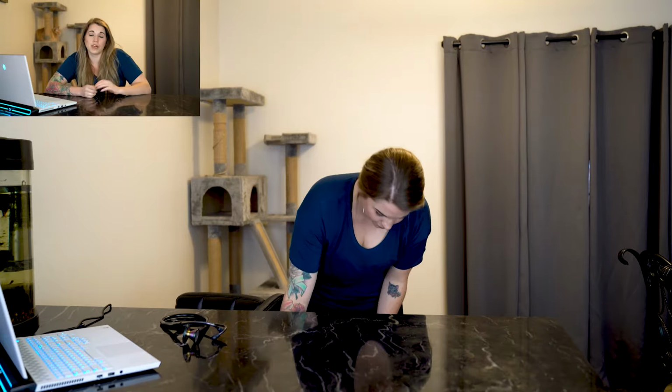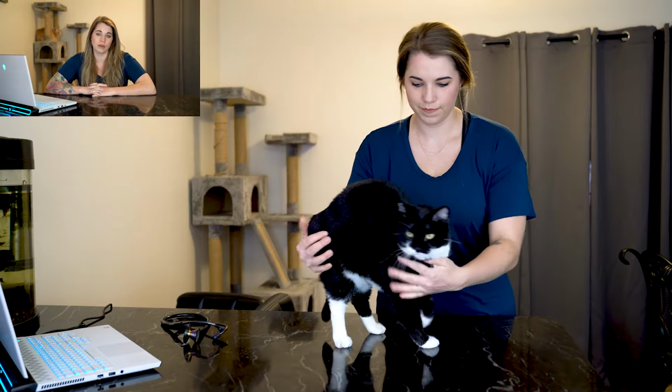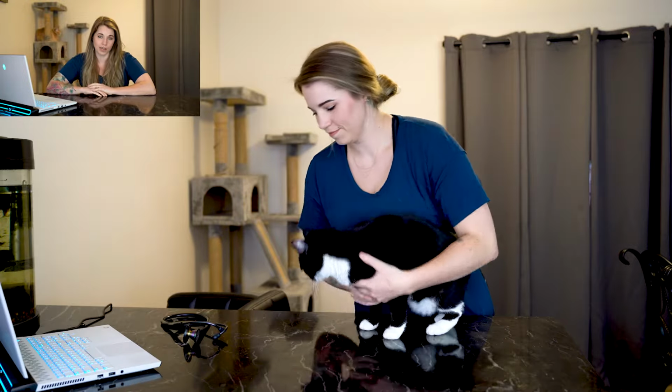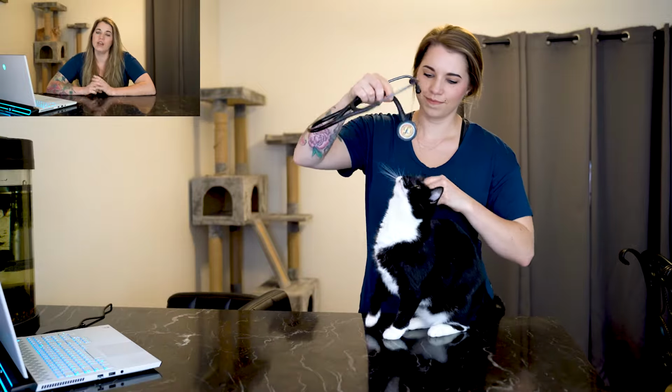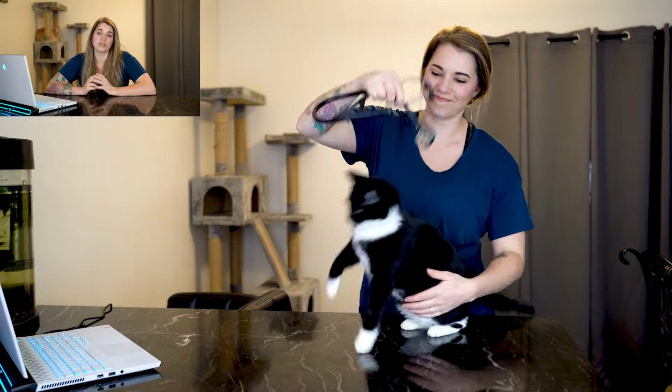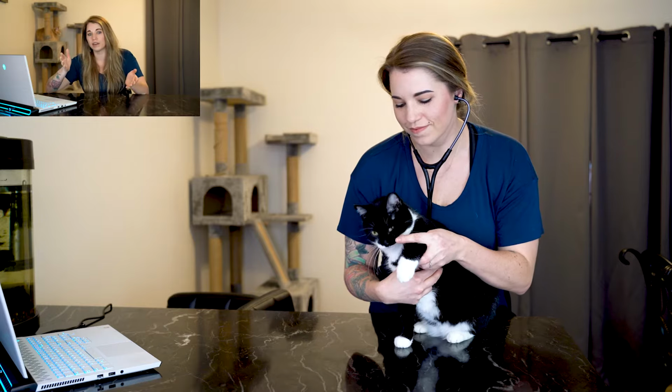Our next vital parameter is going to be the heart rate. And we should get a heart rate by listening to our patient. Palpating for a pulse is considered a pulse rate, not a heart rate, because these two numbers can be different. So you should get out your stethoscope and you should listen to your patient's heart. You can listen from the left side or the right side. I like to do both because the heart can sound different from left to right.